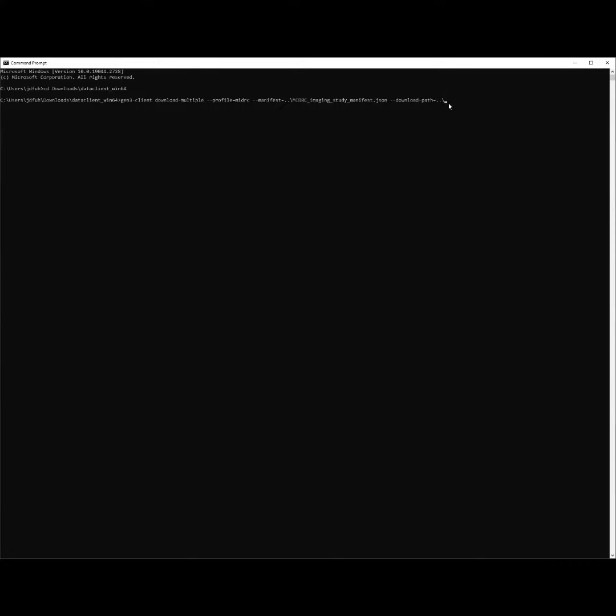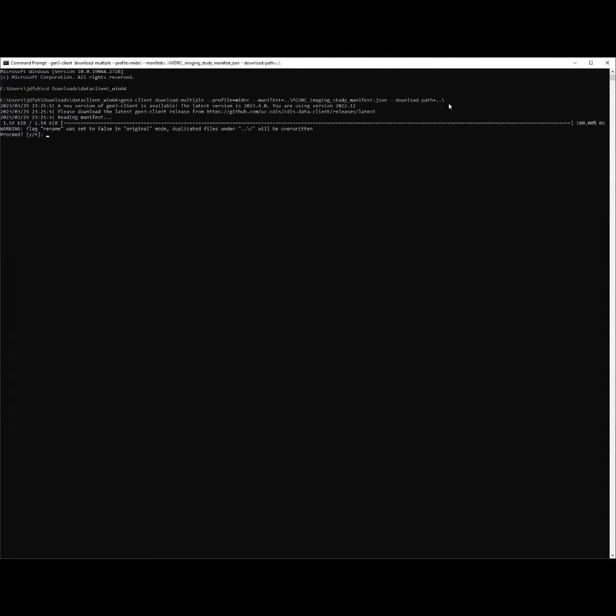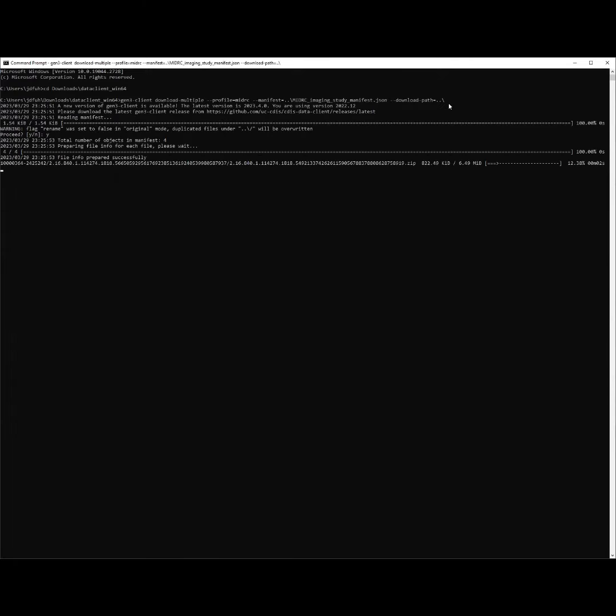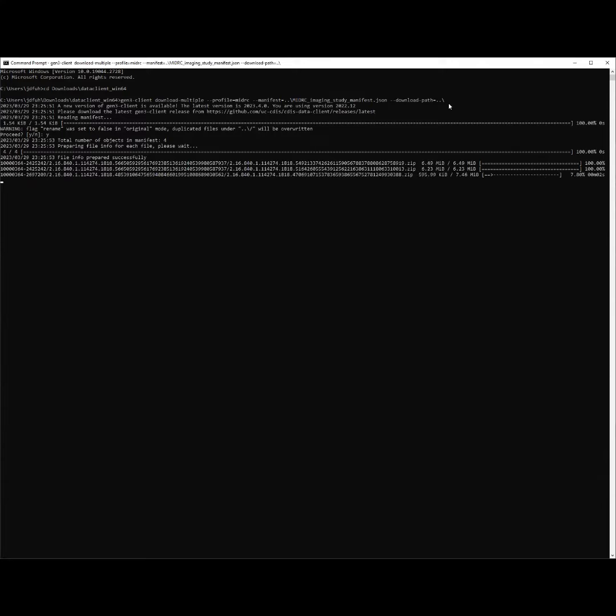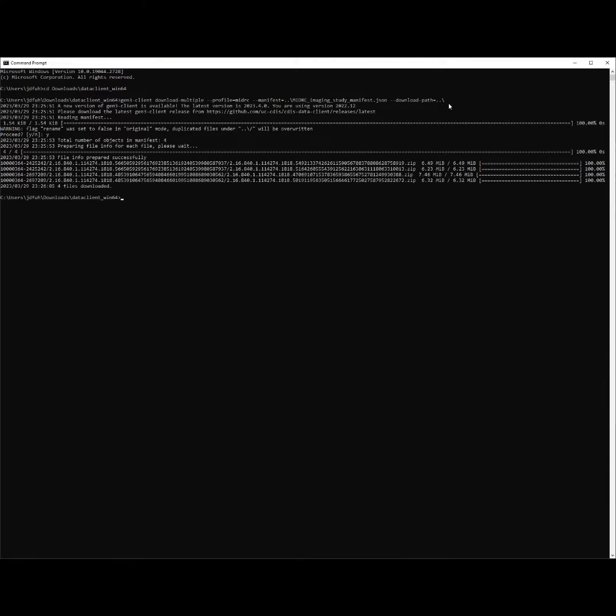I will now begin the download process for a pre-selected small demonstration cohort. As you can see, the files are being downloaded, and the download was successful.